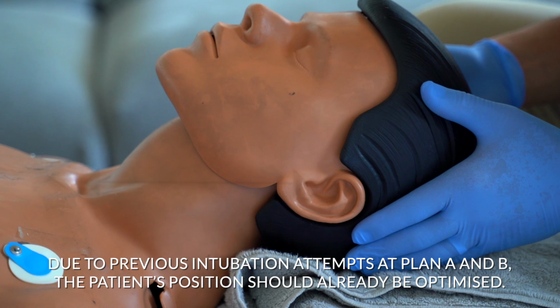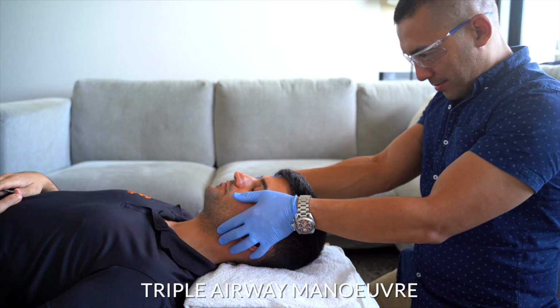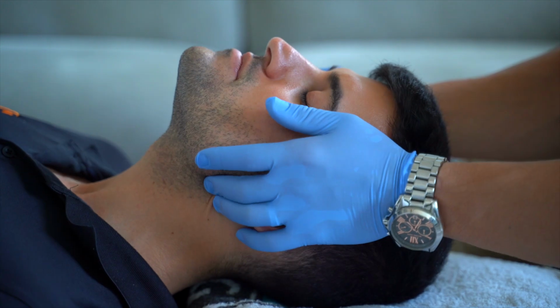To optimize position, ensure the patient's external auditory meatus is in line with their sternal notch by placing the patient into either a sniffing or ramp position. Manual maneuvers such as a triple airway maneuver are also useful in improving airway patency. The triple airway maneuver comprises head tilt, jaw thrust, and opening the mouth. Head tilt pulls laryngeal structures away from the posterior pharynx. Jaw thrust displaces the tongue forward, and opening the mouth ensures airway patency even where there is an occlusion at the level of the soft palate.